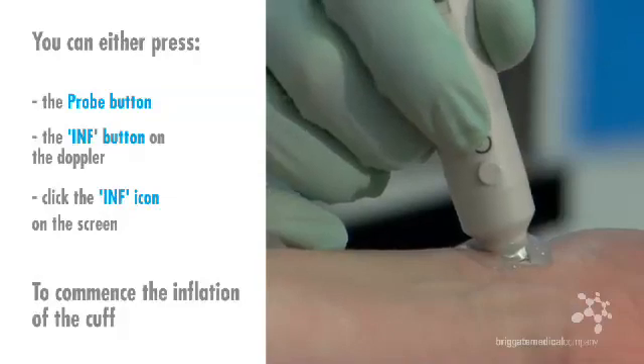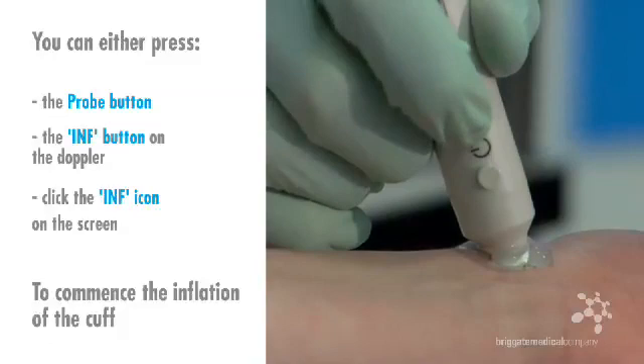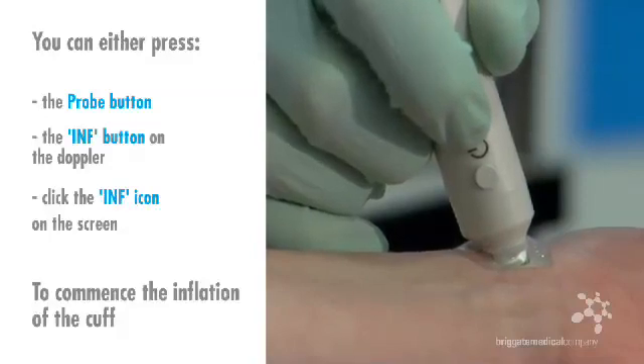Once comfortably in position, you can either press the probe button, the inflate button on the Doppler, or click on the inflate icon on the screen to commence the inflation of the cuff. It is now important not to move the probe until the entire process is complete and a systolic pressure is obtained.